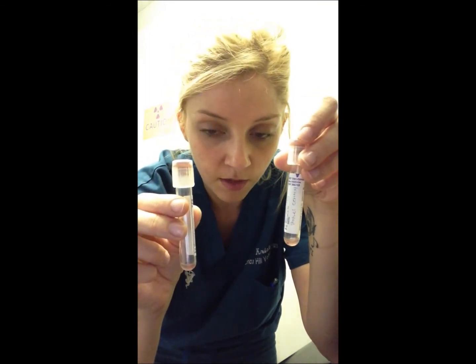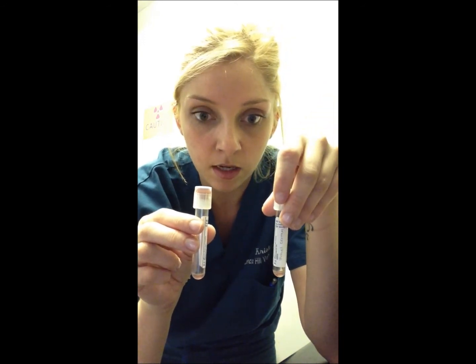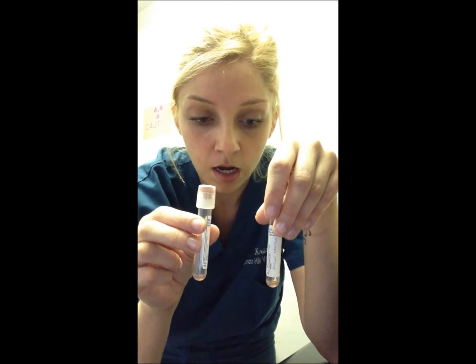Okay, these are our control tubes. As you can see, they both have a clear supernatant, so that reveals that there is no autoagglutination. And like I said previously, the recipient's blood mixture came back with some hemolysis, and the donor's did not, so they still are not a match because the supernatant needs to be clear in order for it to be a match.